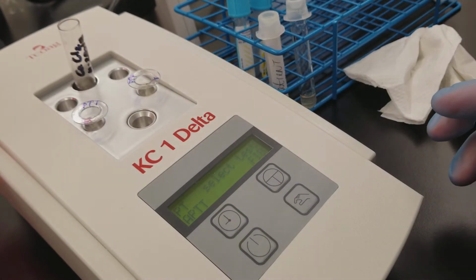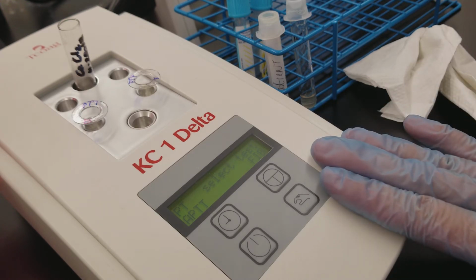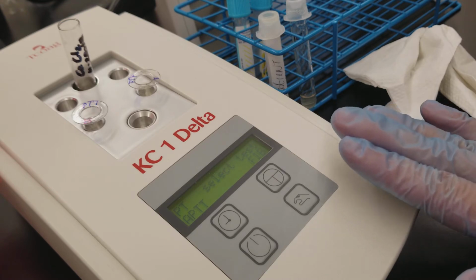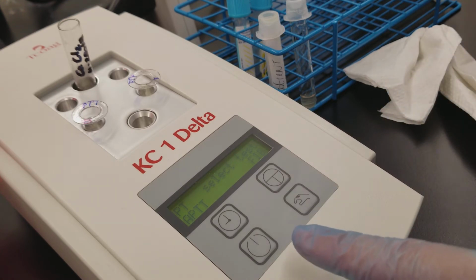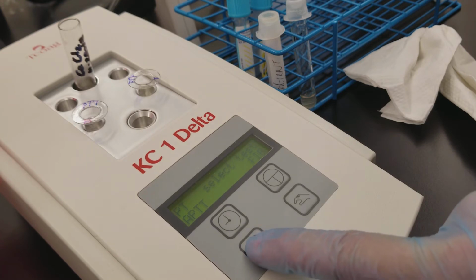You want about a 5 to 6 minute incubation time, although that's not what our analyzer is set to. I know that it takes time to add that in there, so by the time you're ready to actually start the test, it's going to have been about 5 minutes, because I'm being realistic here. So, okay, we want to do PTT testing. So I'm going to press this power looking button.